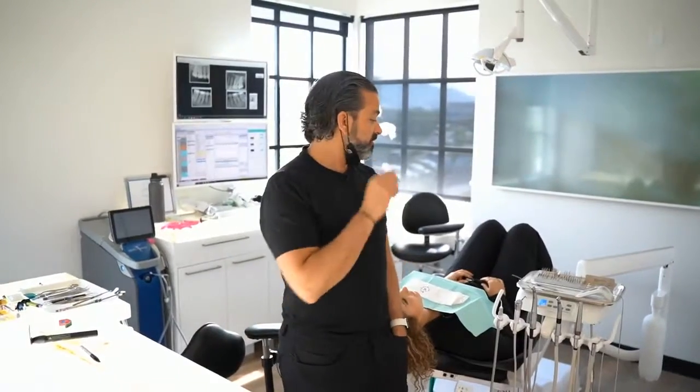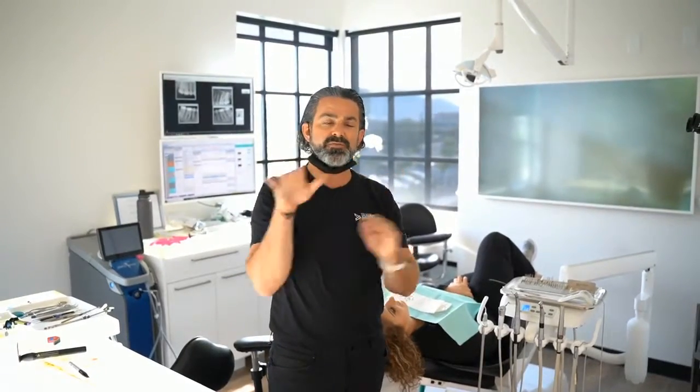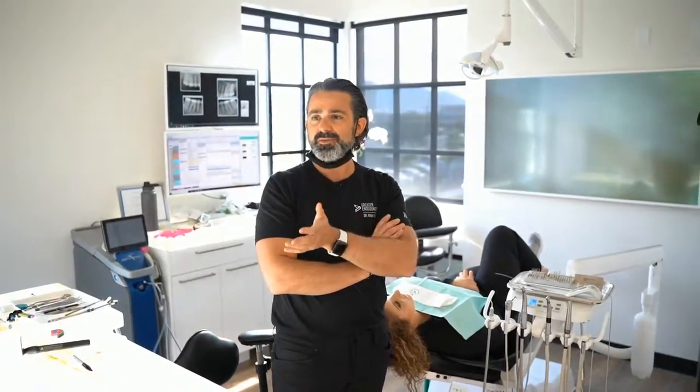Oh, it's too bad I am not doing a crown prep for you guys. Crown prepping under a microscope is phenomenal, because you can see the shadows and you can see the details of your crown prep in a way that I can't really explain unless I could show you. Vicki, would you want me to crown prep a tooth? Could you imagine me as an endodontist crown prepping a tooth?